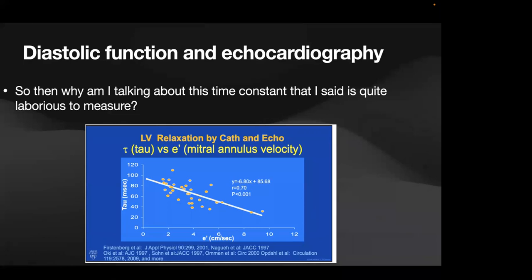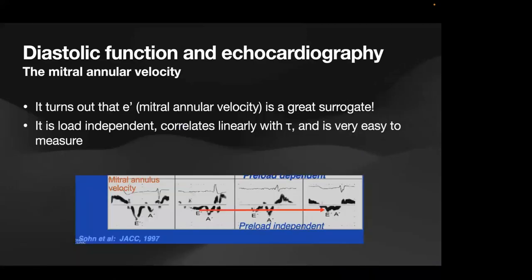So that's a neat little trick to try to figure out. If you think about it, what we're trying to do is figure out what the filling pressure of the left ventricle is, but we're using some fancy techniques to figure out a little bit, not only of the pressure changes, but of the tissue characteristics themselves. So it's really kind of cool.